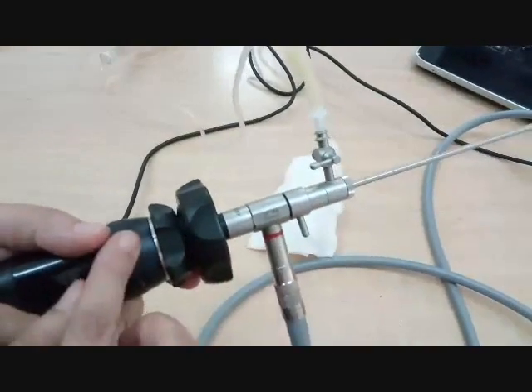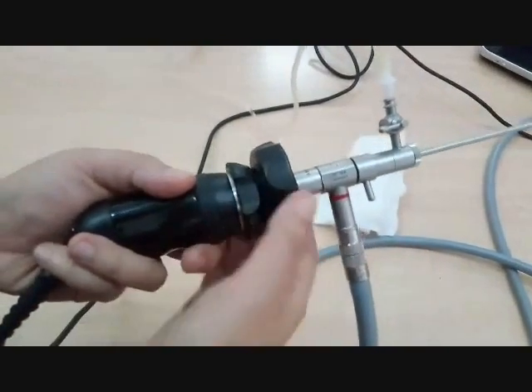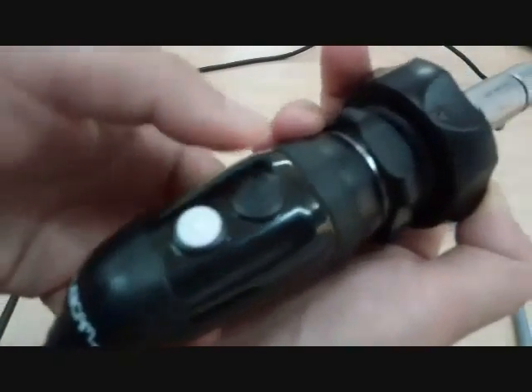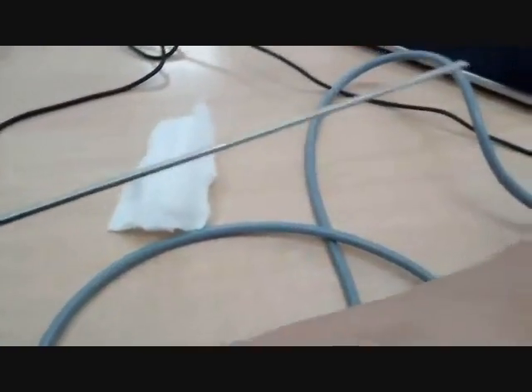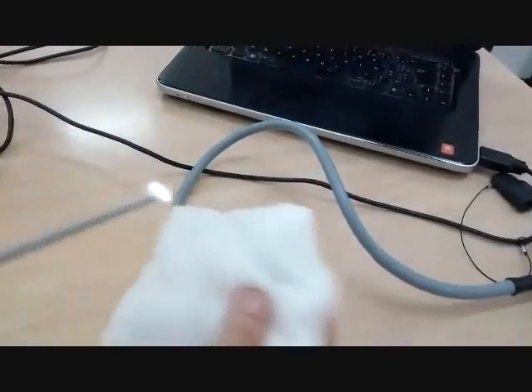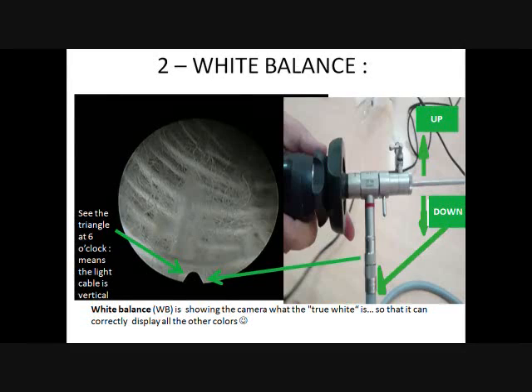Second point is the white balance. See, the scope, the light attachment, and the camera. Remember, we said that there are 2 buttons on the top of the camera. The black one for recordings and the white one for the white balance. So all we have to do is to turn on the light like that and come with the white compress near the scope to make it recognize the white color. And here's what we see on the screen, a white compress.